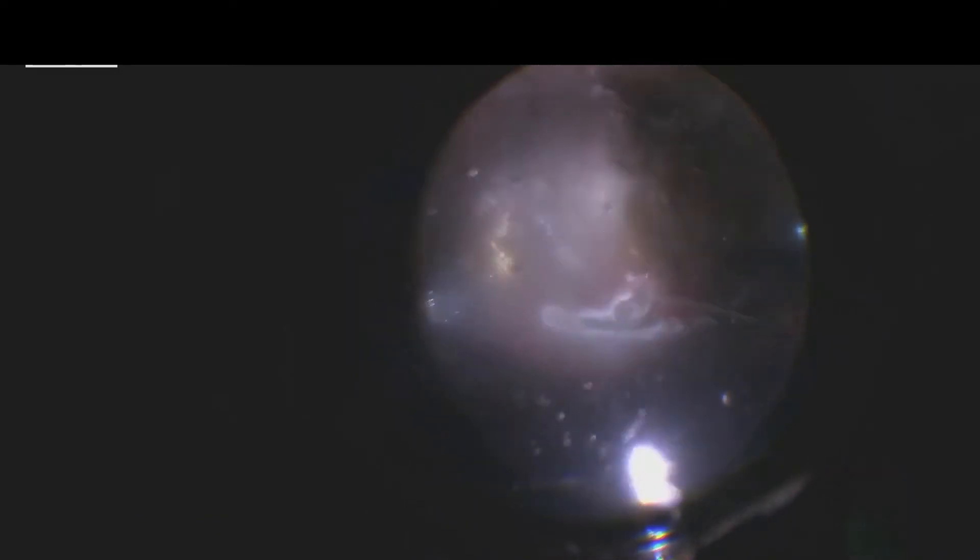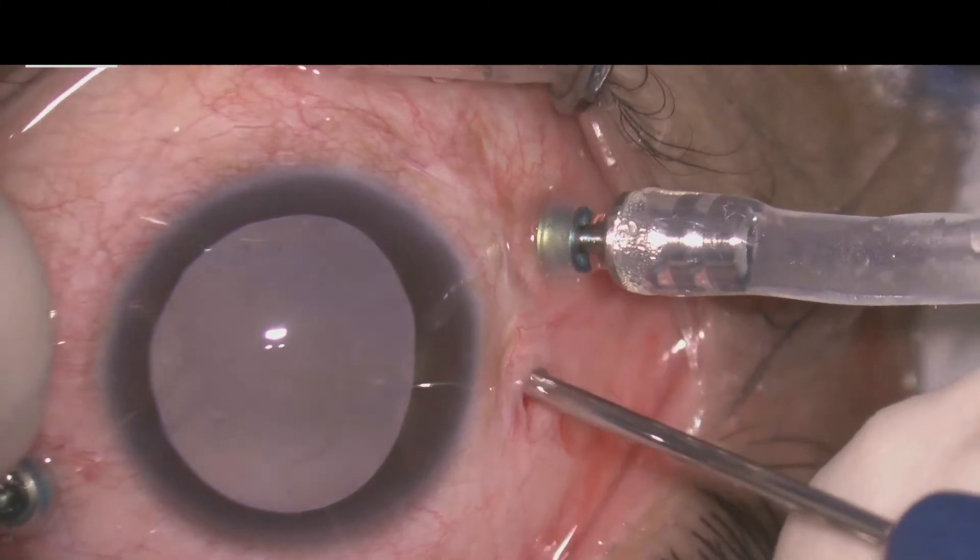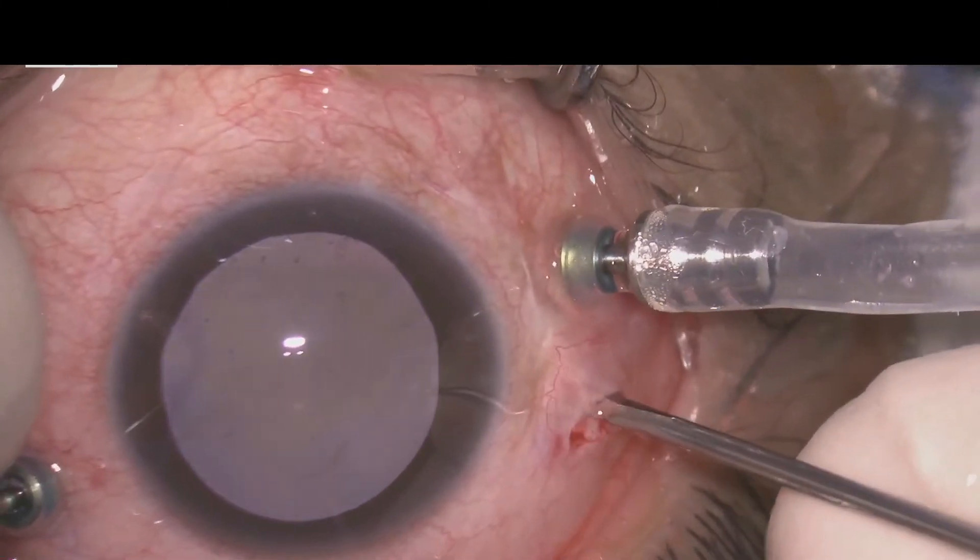The endoresection of the tumor was performed using the 23-gauge cutter and later it was switched to 20-gauge cutter, and the endoresection was performed at a lower cut rate. The retinal flap was extended to expose more of the tumor and the endoresection was continued.